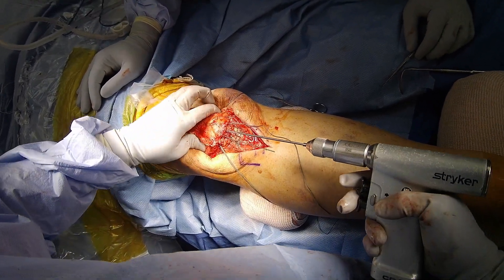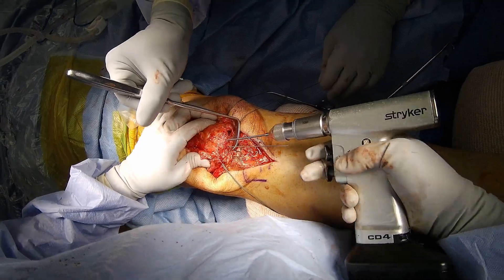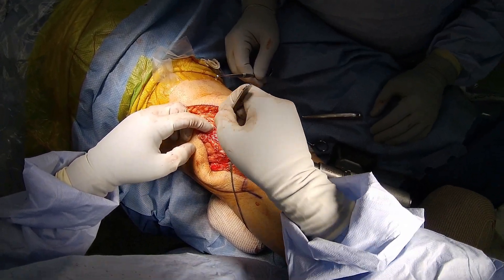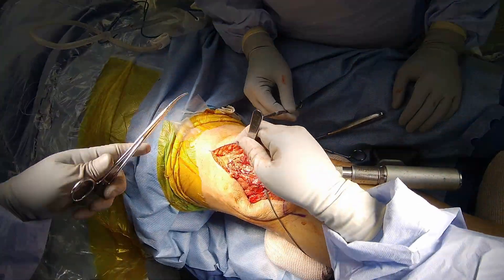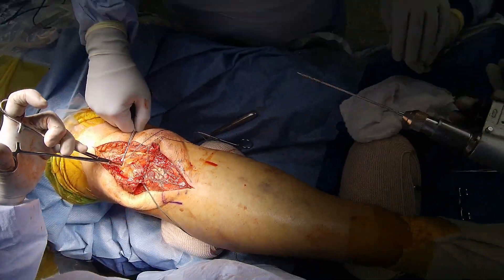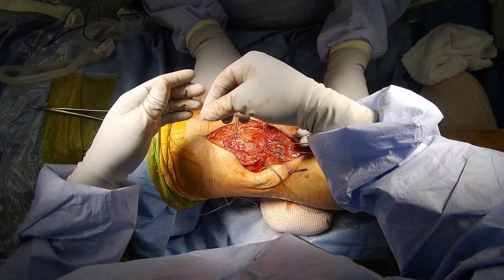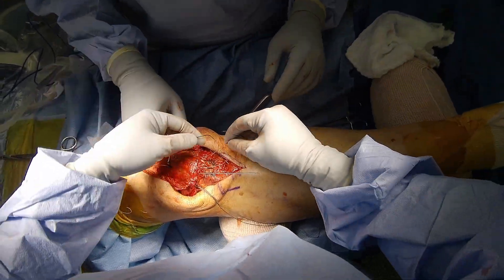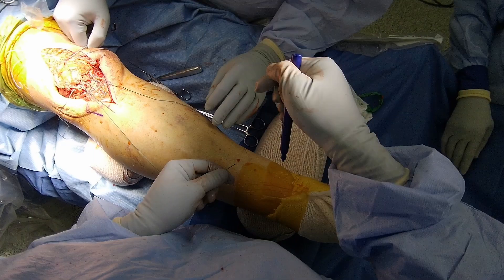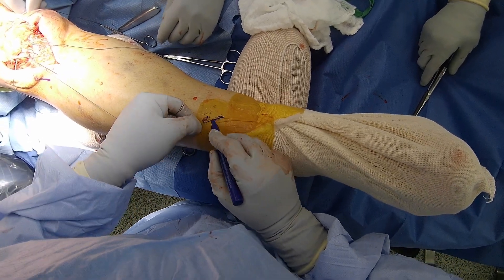I overdrill the middle hole the same way. I pass the Hewson and shuttle the suture. I prepare to pass the two middle hole sutures, which are the lateral limb of the medial suture and the medial limb of the lateral suture. In order to not mix up my sutures, I mark the end of the lateral pair. I then repeat the drill and pass technique for the lateral suture thread.